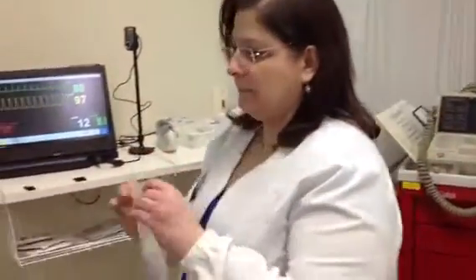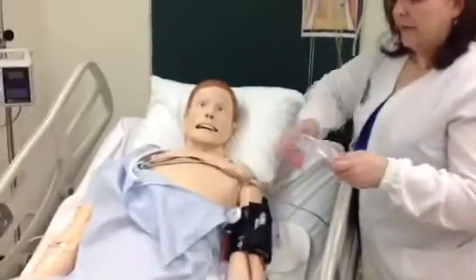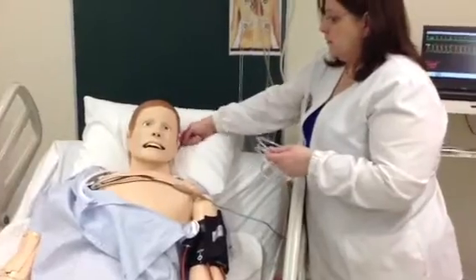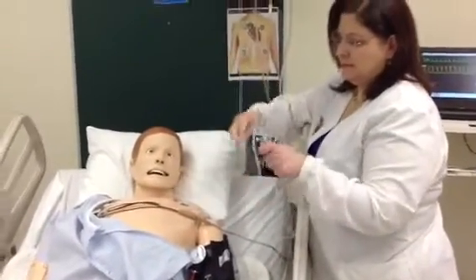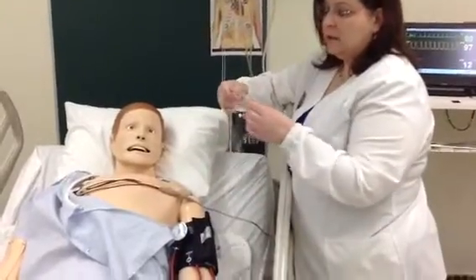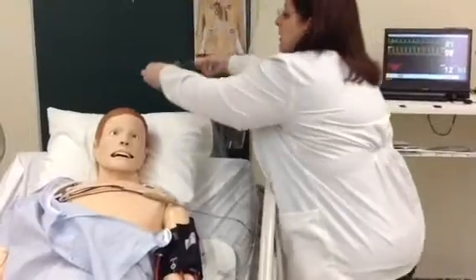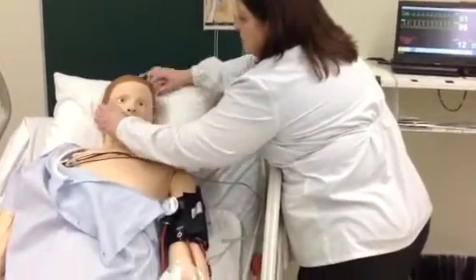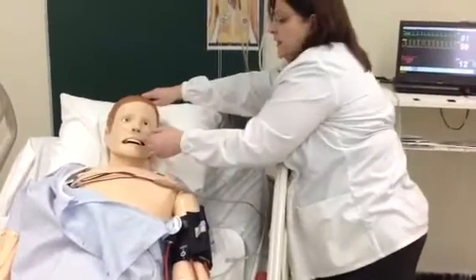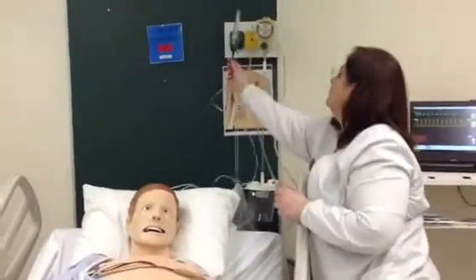I do want to show you his oxygen. His ears are almost non-existent. One way that you can put the oxygen on him, it's a little easier, is if you put this behind the head and put these in the nose. That's perfectly acceptable, and it will stay on a little easier. Plug it on, plug it in.